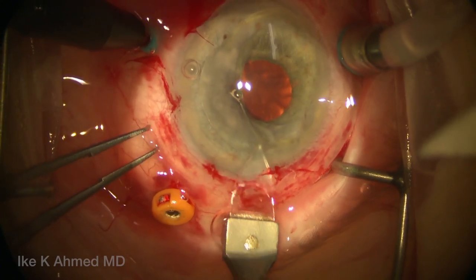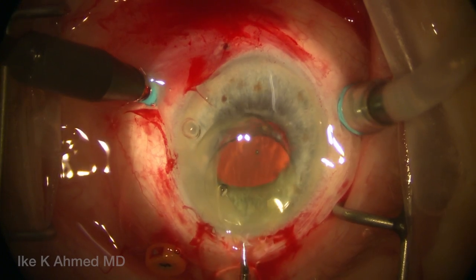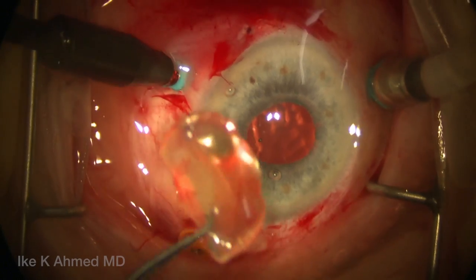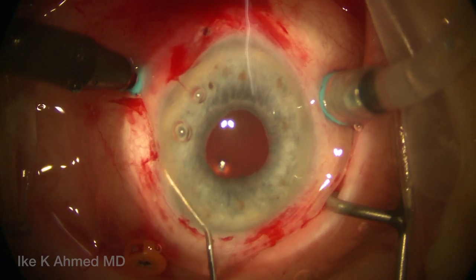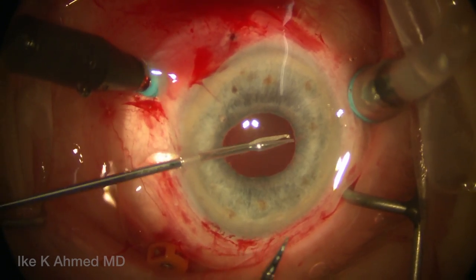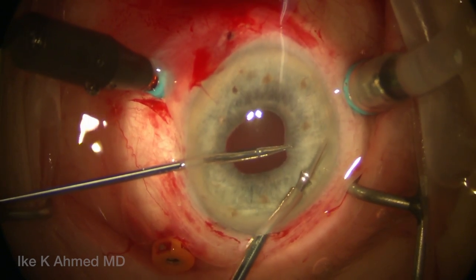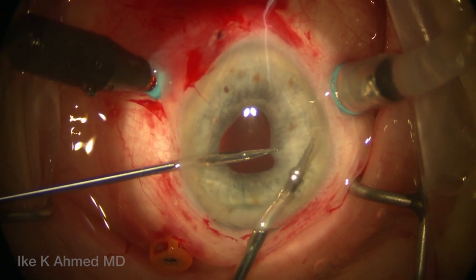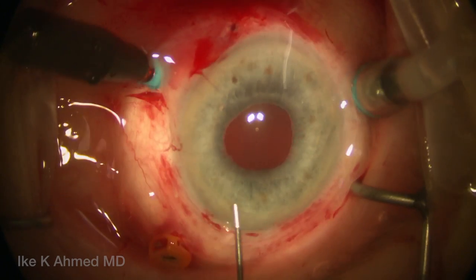Some further dispersive viscoelastic is injected behind the IOL, and the incision is now opened up. This is a foldable lens — we could have cut the lens in the anterior chamber — however, we're going to be placing a one-piece PMMA artisan iris claw lens, so the incision is opened up. There's the IOL-bag complex. We irrigate any potential residual tissue in the angle, and then we're going to perform an iridectomy using micrograspers and microscissors to create a superior iridectomy to protect against pupil block, which is a risk in these patients postoperatively. The use of microinstruments is helpful to do this in a small-incision manner.